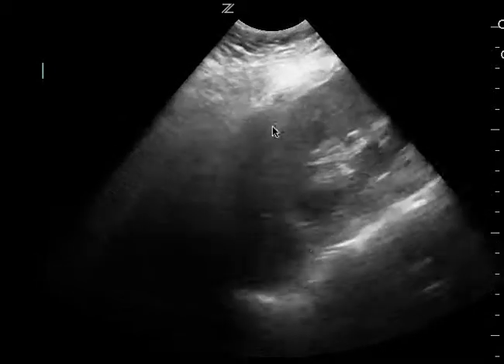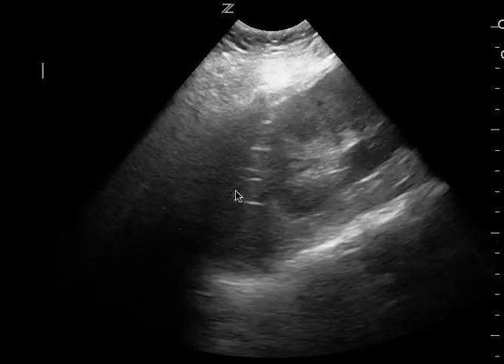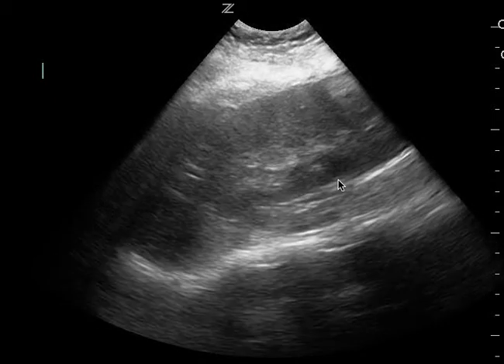My only suggestion is that I would move the probe a little bit more posterior towards the bed. That way you get the shadowing, which is most likely air, out of the way so you can better see what's going on.